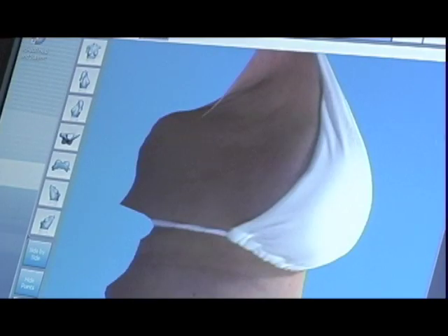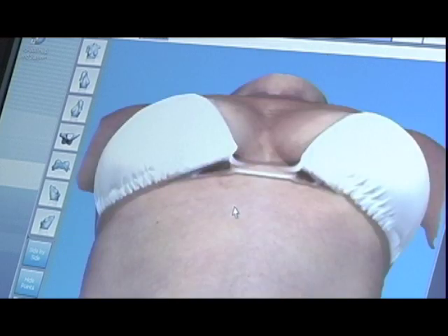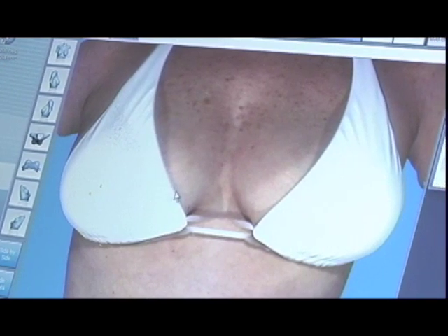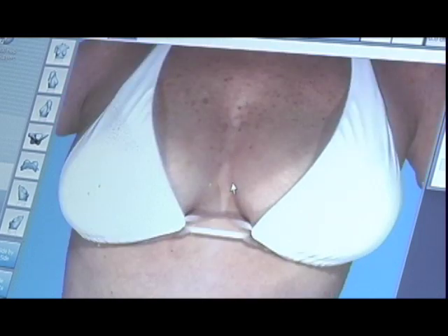Next, we mark the various parts of the breast so the computer can use that for its calculations. First, we mark the outer part of the breast, then the crease underneath the breast. Now we mark the nipple, and we mark the edge of the areola, which is the darker tissue around the nipple, and then the inner part of the breast. Then we mark what's called the sternal notch at the upper part of the sternum, and then the same spots on the left side.